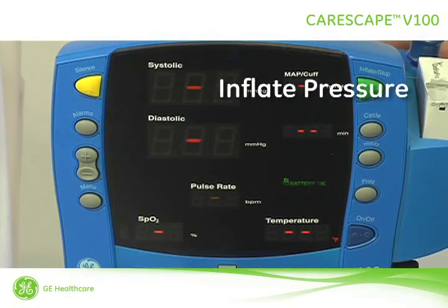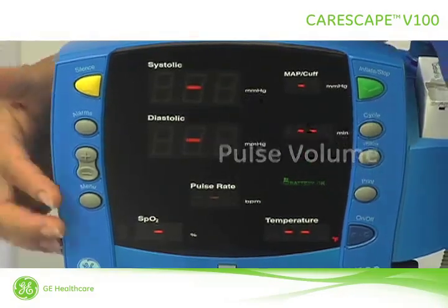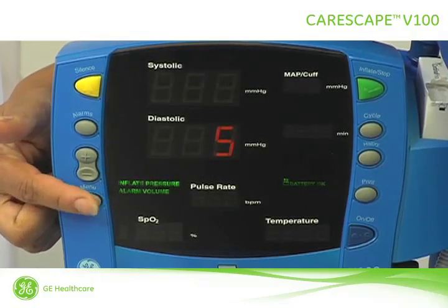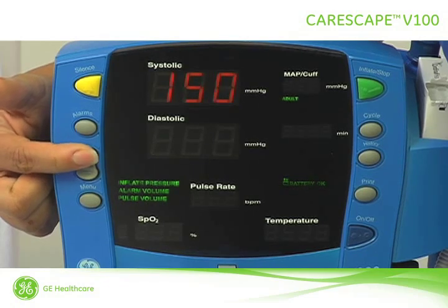To view and adjust the target inflation pressure, alarm volume, and pulse volume, press the menu button until the option that you want to change is blinking. Then press the plus or minus buttons to adjust. Here we're setting the set point for adult pediatric inflation pressure to 150.